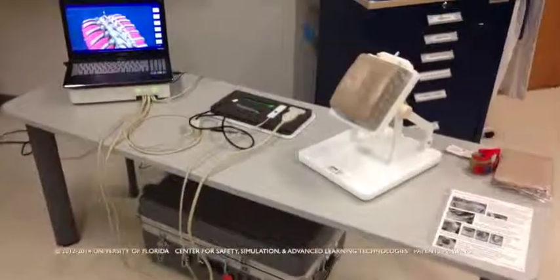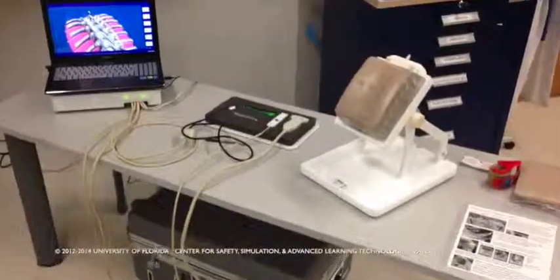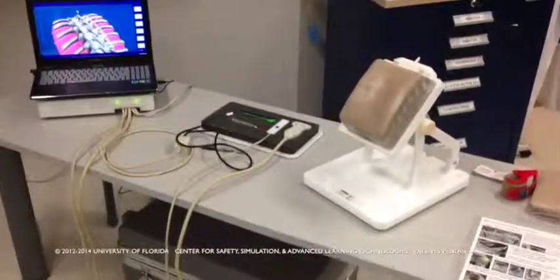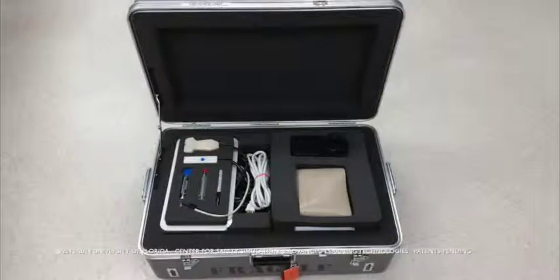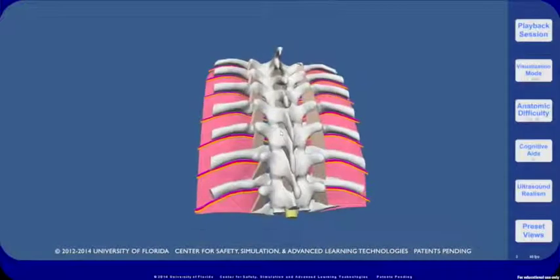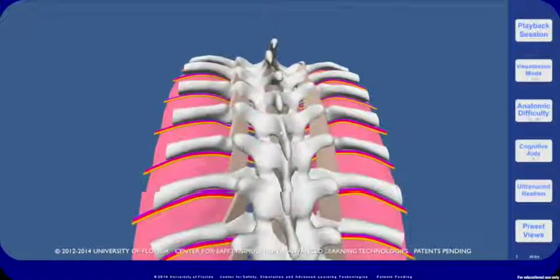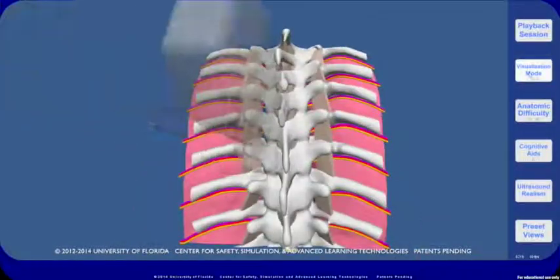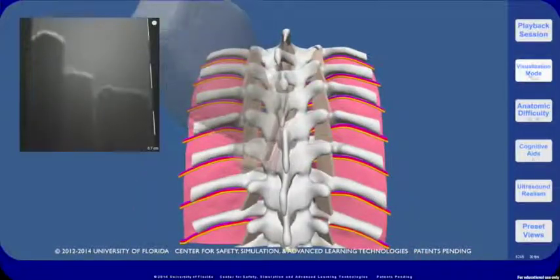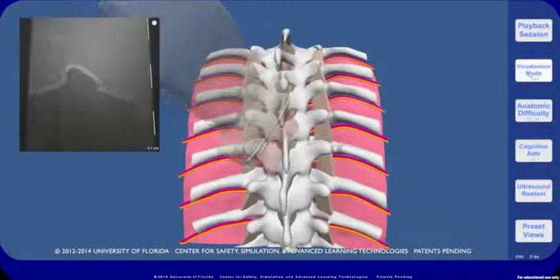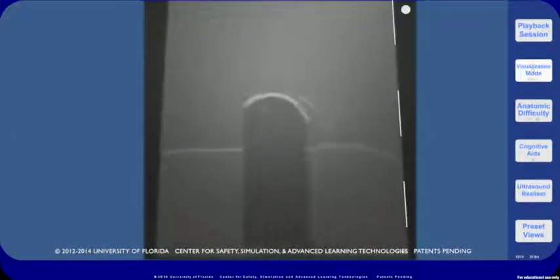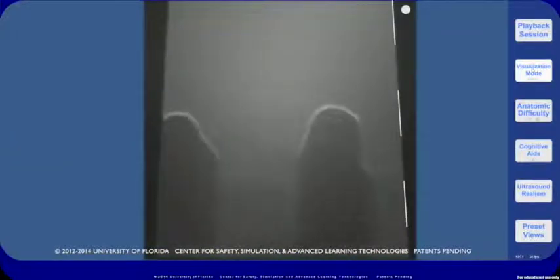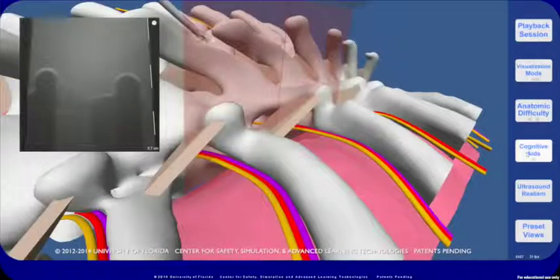Welcome to the Regional Anesthesia Mixed Simulator. This compact unit simulates the proper procedure for thoracic paravertebral blocks and placement of thoracic epidurals with and without ultrasound guidance. It is dry, requires no fluids, and may be set up in five minutes.